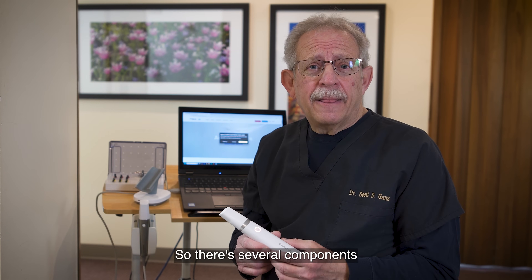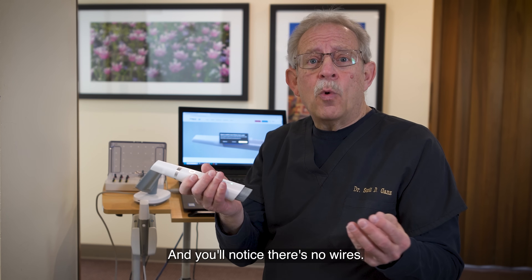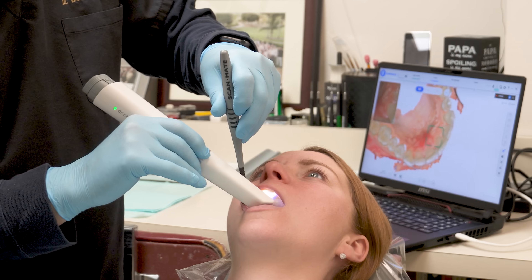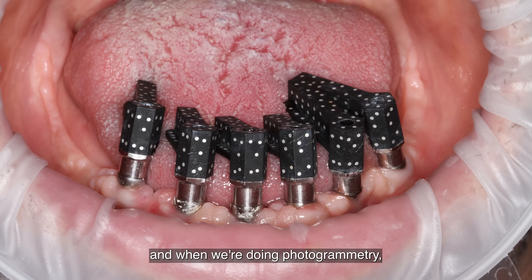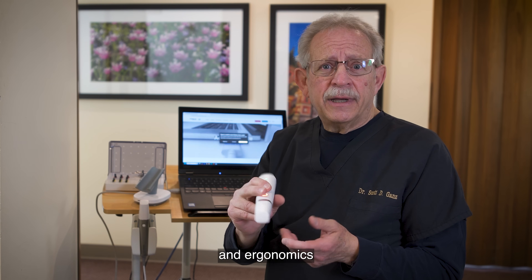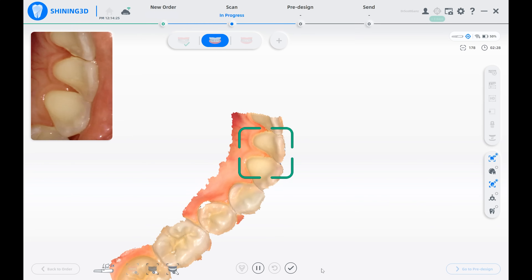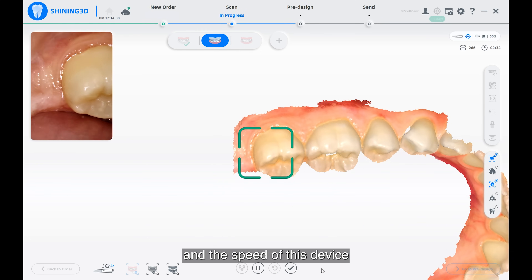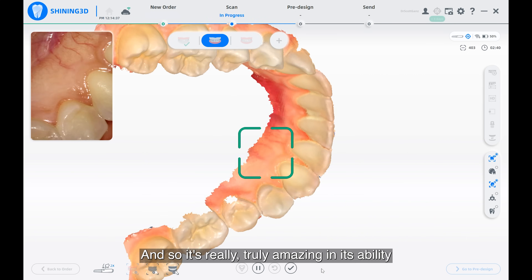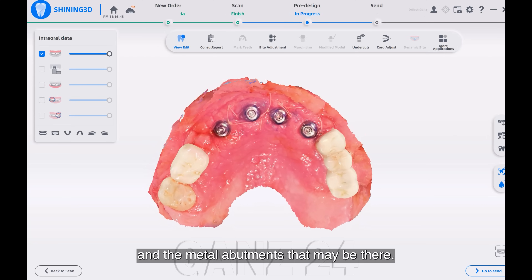There are several components that are really striking about this device. It's very portable, very light, and there are no wires. That wireless capability is really important when we're trying to manipulate the scanner in a patient's mouth, especially for full arch implant restorations and photogrammetry. Having worked with many devices in our industry for over 35 to 40 years, I can say the accuracy and speed of this device is equal to anything I've used as a top-notch scanner.